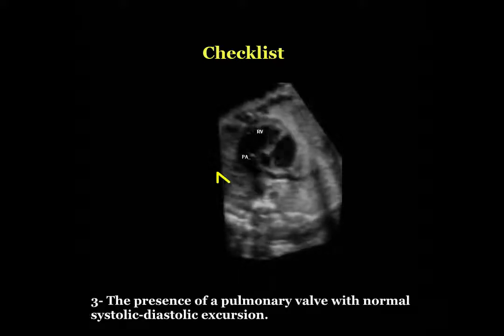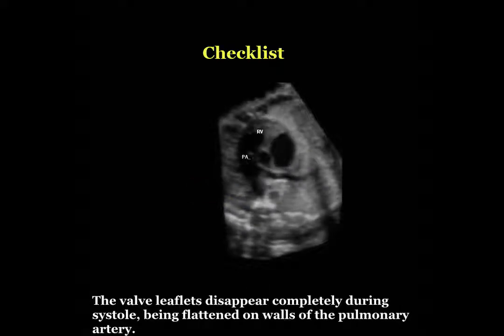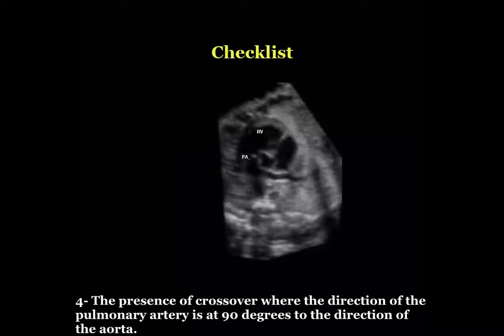as the ductus arteriosus. Third, the presence of a pulmonary valve with normal systolic-diastolic excursion. The valve leaflets disappear completely during systole, being flattened on the walls of the pulmonary artery. Fourth, the presence of crossover.